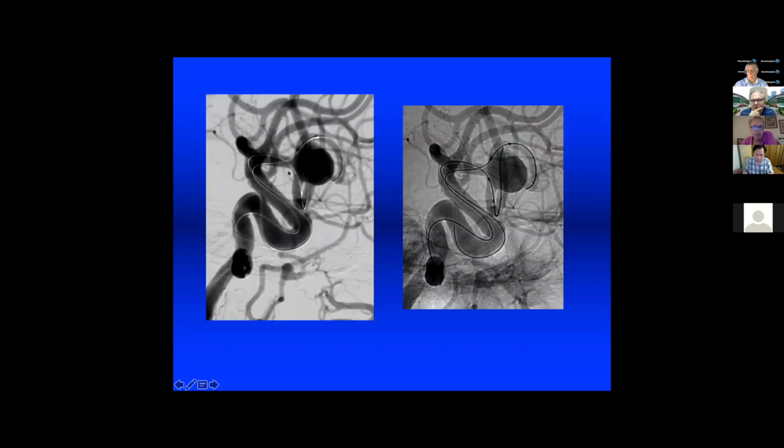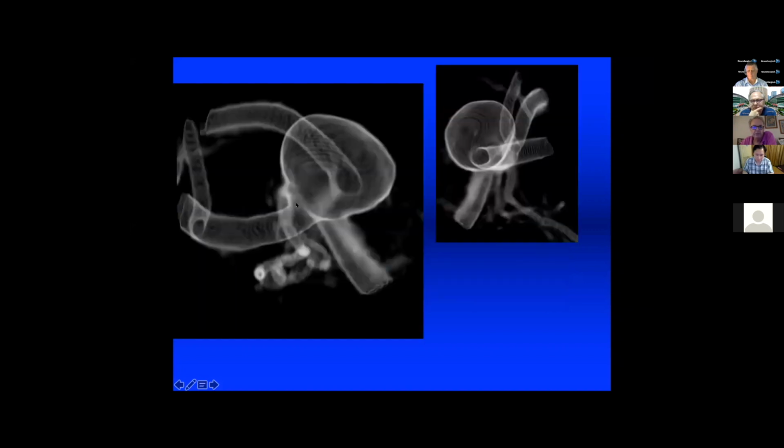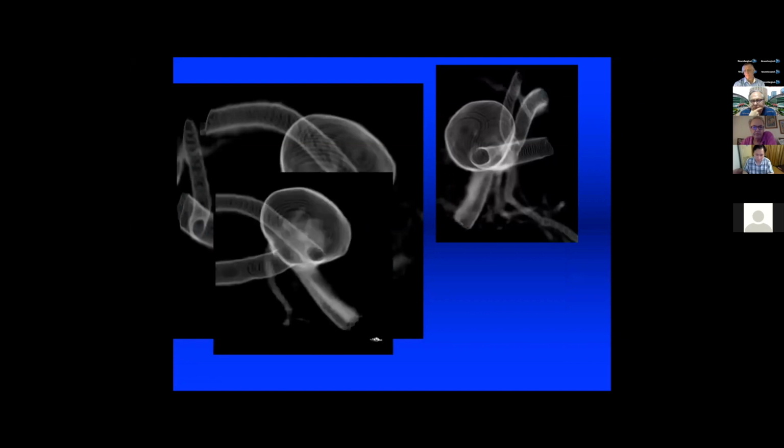I put a second catheter and balloon in the inferior branch of the middle cerebral artery, double balloon for double remodeling. But this is a picture as an example of balloon. When you put the coil and you deflate the balloon, the coils go out through the neck. This is a danger, no? You must be very careful in this situation.